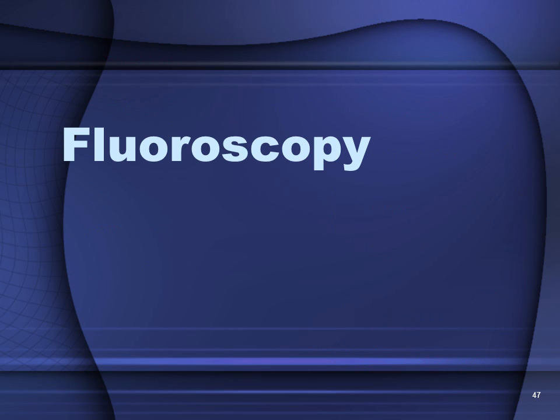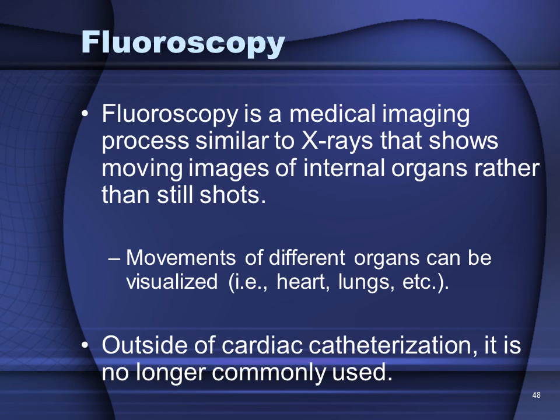Now, let us briefly discuss fluoroscopy. Fluoroscopy is a medical imaging technique that is similar to X-rays, but in this case it shows moving images of the internal organs rather than still shots. So we can look at the movements of different organs, such as the lungs and the heart, etc. And it can also be used for cardiac catheterization and angiography. And actually, outside of cardiac catheterization, it is really no longer commonly used.